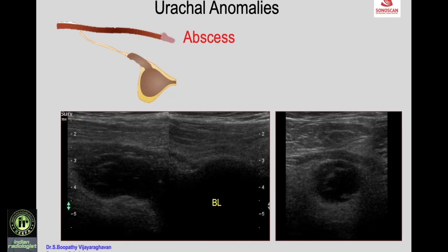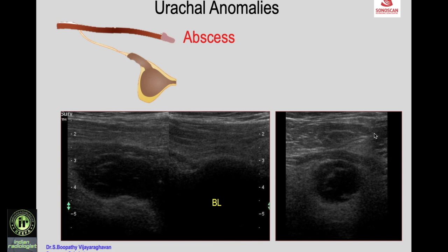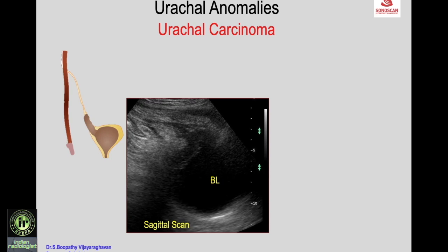A rare urachal abnormality is abscess associated with persistent urachus. A patient with urachal vesical diverticulum presenting with fever, suprapubic pain, and dysuria shows the bladder with the persistent urachal vesical diverticulum surrounded by inflamed fat, which is tender. Transverse scan shows inflamed fat, and an abscess within the urachal vesical diverticulum is identified.